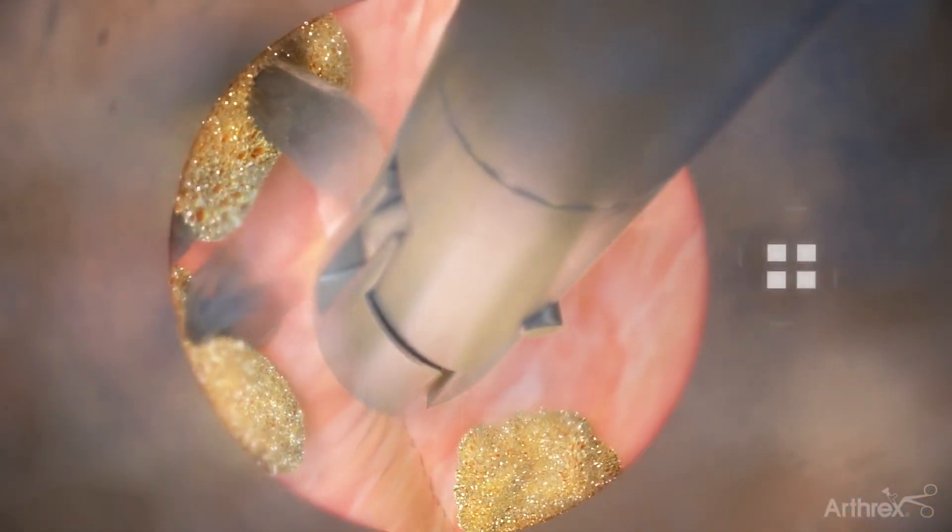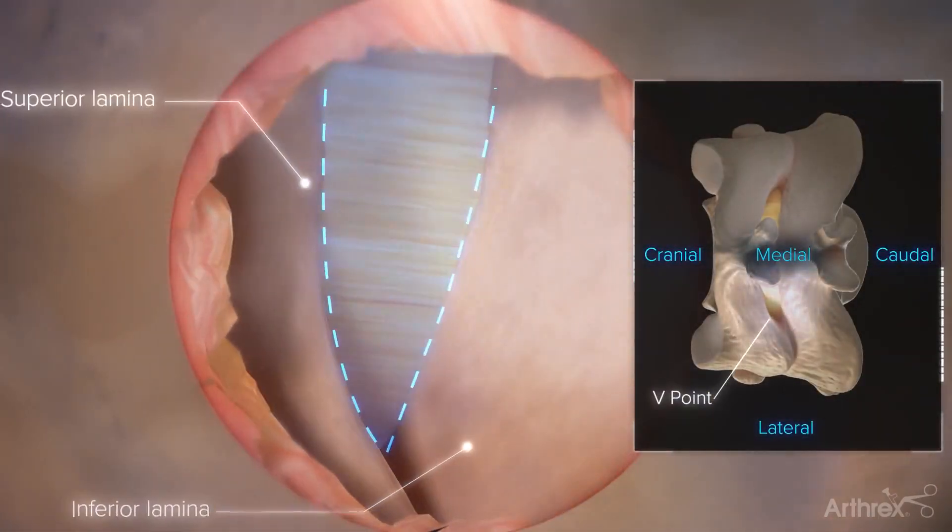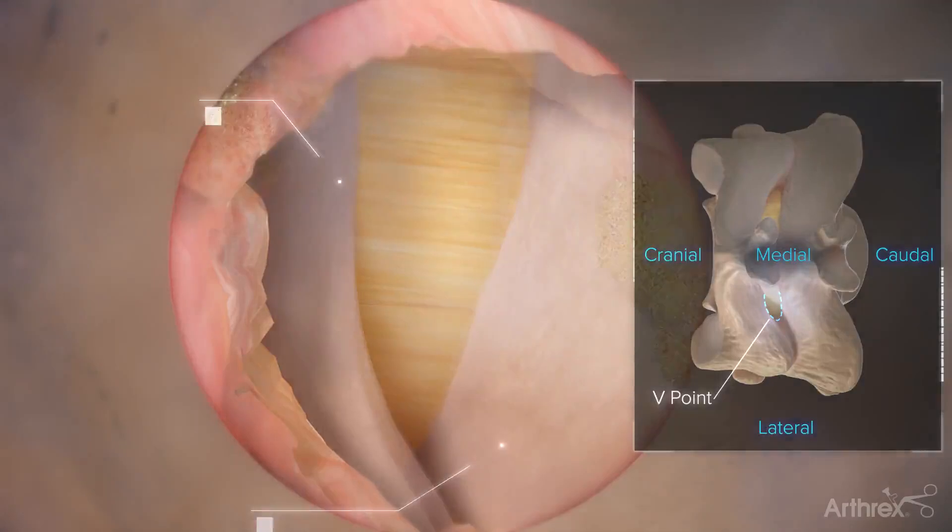Expose the upper and lower lamina, revealing a V-point. Using a high-speed burr and/or Kerrison rongeurs, remove bone to convert the V to a U.